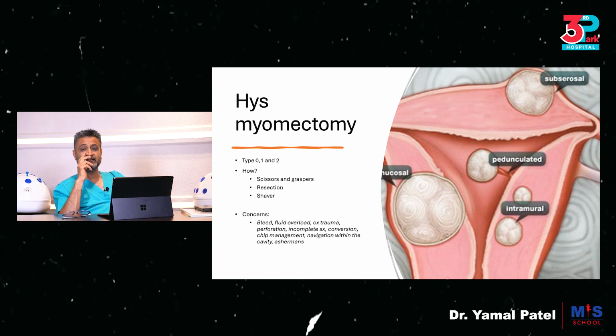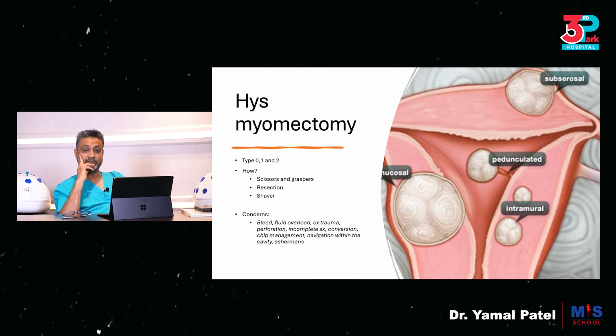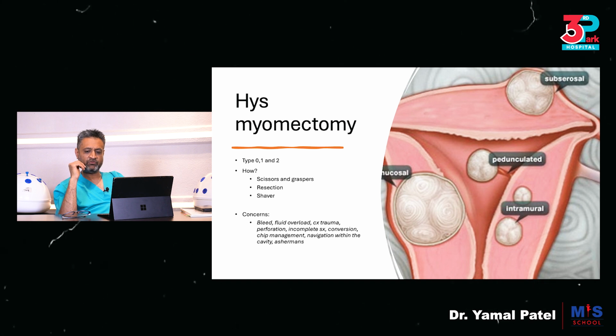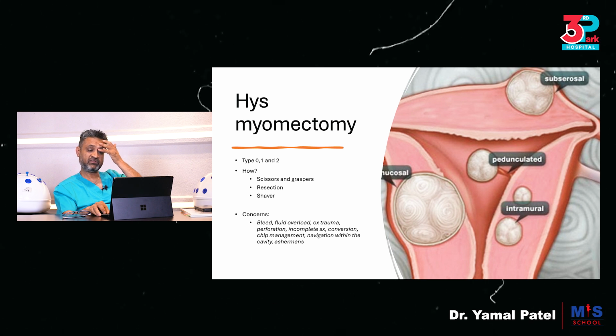So the concerns we have with myomectomy is bleed, because if you are not in the right plane, then you'll start bleeding and that disrupts your procedure. Fluid overload, very likely if you open up channels. And as you're going on resecting and it takes longer and longer, the amount of fluid being used is going to be increasing, and therefore you have risks of fluid overload. Cervical trauma is possible. Perforation, very possible.